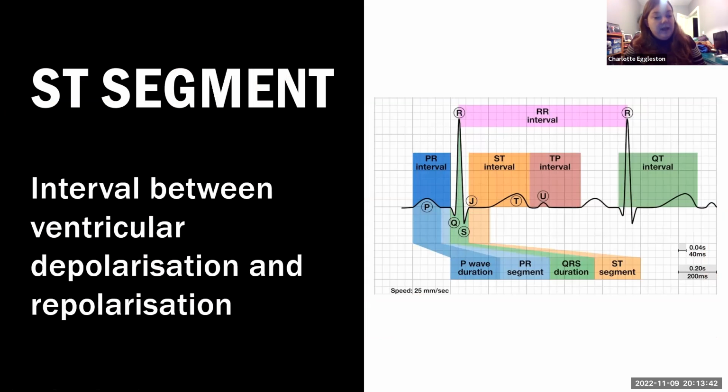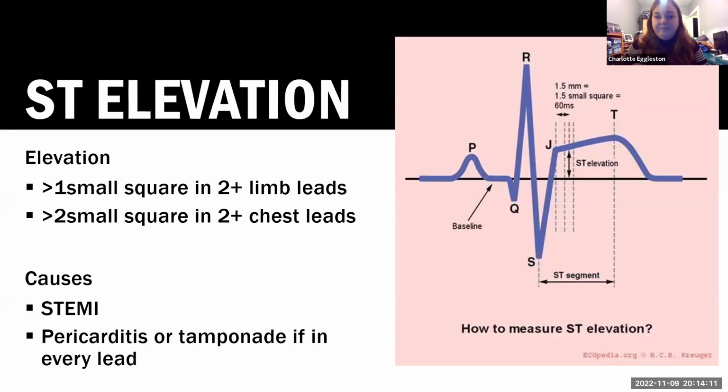And then we're getting on to the ST segment. I think that's probably the bit that excites everyone the most, because more exciting bits happen in ST. We'll do this bit, and then we've got to talk about QT interval briefly, and then T waves, and we'll leave today's session. Tomorrow's will be a bit shorter, but it'll be more ECG heavy, and we'll apply everything we've done today. So the ST segment is that interval between ventricular depolarization and repolarization.